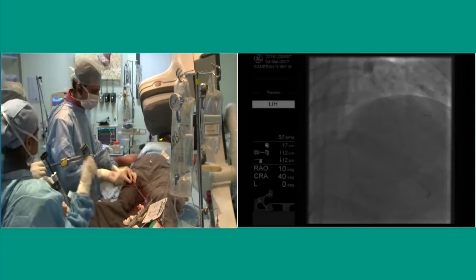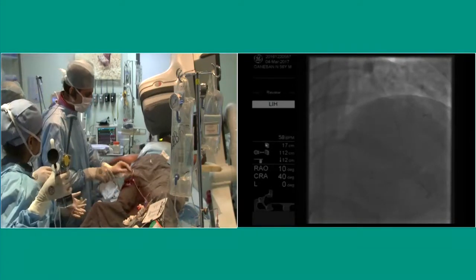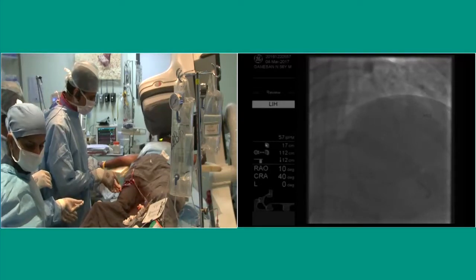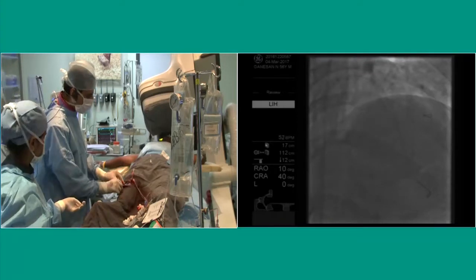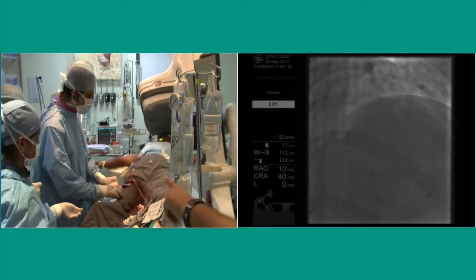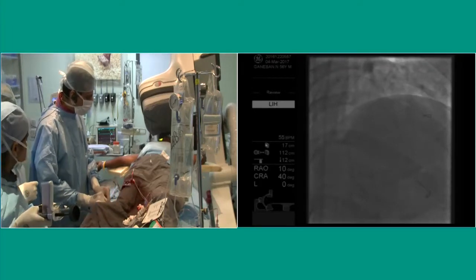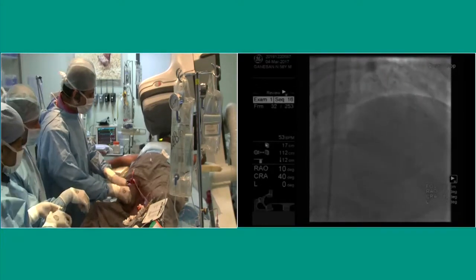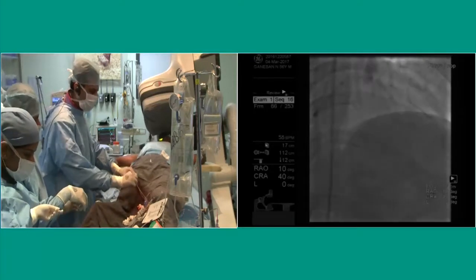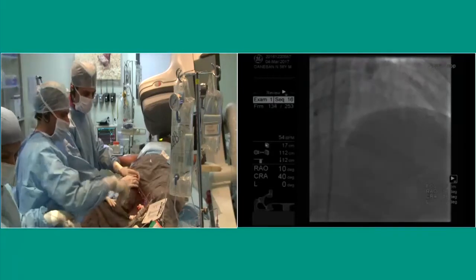Excellent. Did you consider at some point also doing a middle stent optimization right after the bifurcation? I did some of that. Can you show that? I used the same balloon, a 3.5. Because it's a 3.5, I just went only 8 atmospheres distally. Maybe after the OCT, I would consider doing a high pressure dilatation with a smaller balloon, the NC balloon. So do OCT.